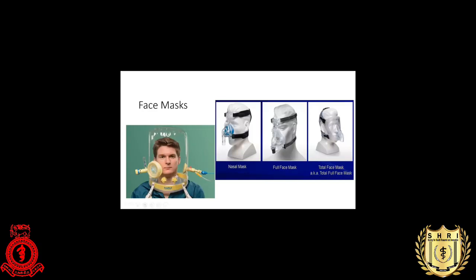Another thing is you have to keep this mask on the patient's face once you start the machine, without putting on the strap, and allow the patient to get used to it. And after the patient gets used to it, you can fix the straps.